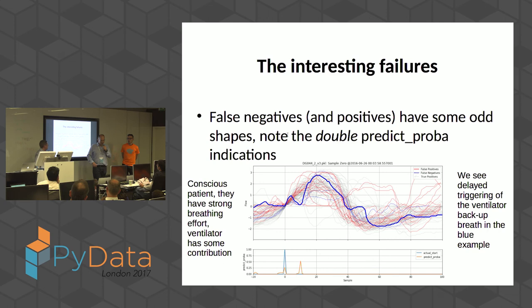Now, to predict that is very difficult. Even though various people have published various clinical indicators of what would predict the patient being able to breathe without the tube, what we usually say to the parents is that we don't know before we pull the tube. But the reality is that, in the longer term, I strongly believe that computers are going to ventilate better than clinicians.